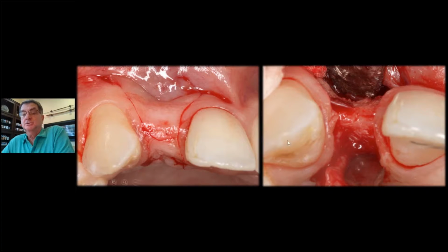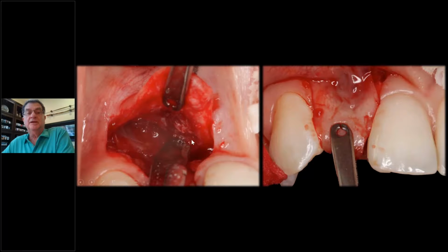So you see the incision. This is what a good papilla sparing incision looks like. That's not going to go anywhere. It's not being touched. Papilla sparing, and it carried around to the palate. Think about 1.5 millimeter tissue on each side. That's what you see here. Release the flap. Periosteal release. That's mandatory for all grafting. That's the key. Got that done.